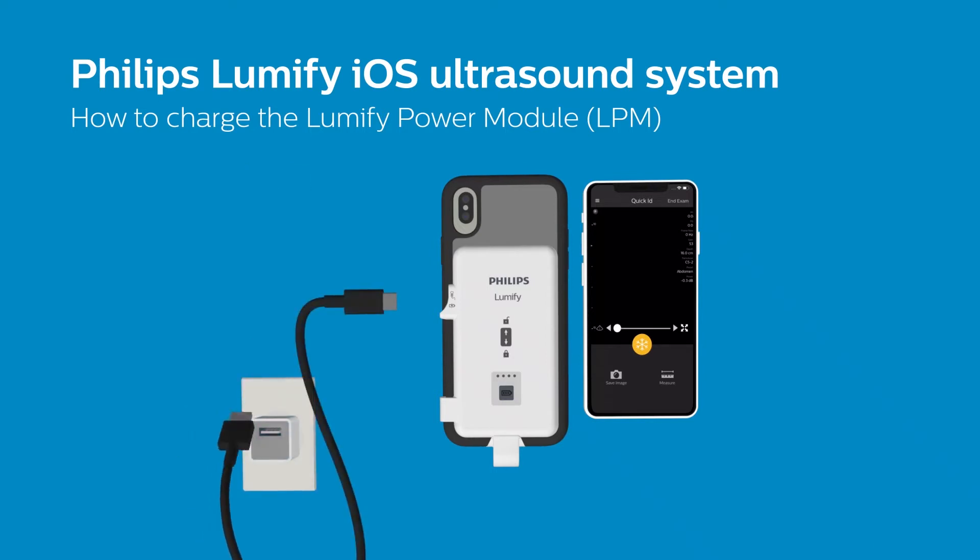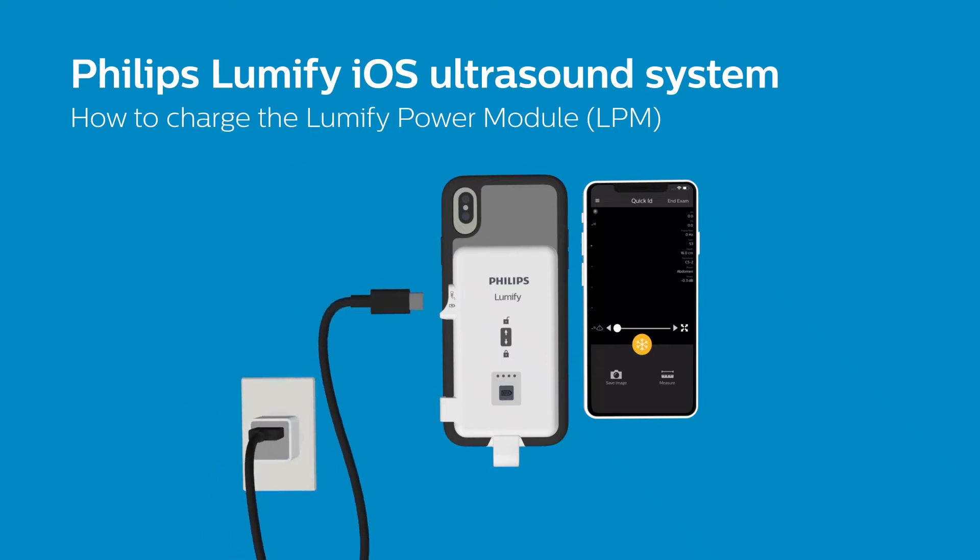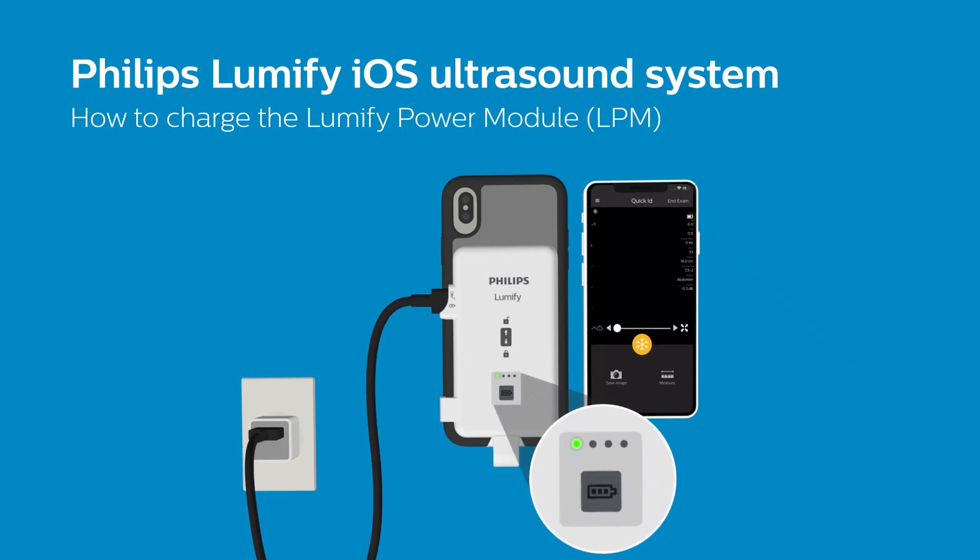Connect the Type-A side to a power source and the Type-C to the USB-C port on the side of the power module.